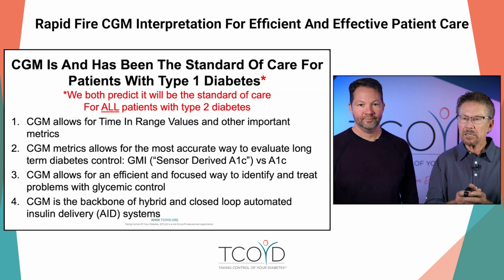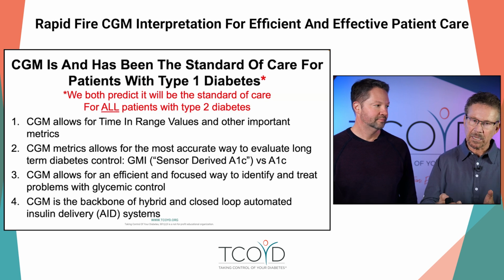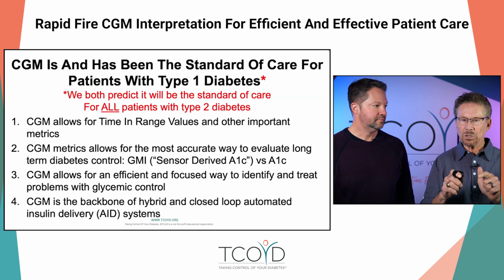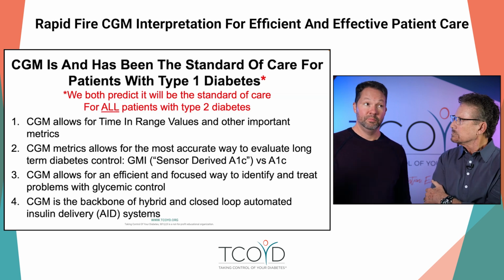And lastly, it is the backbone of a tremendous area, hybrid closed loop systems with automatic insulin delivery. And without CGM, you couldn't have these systems. Yeah. I'd just add there that this is one benefit of COVID.